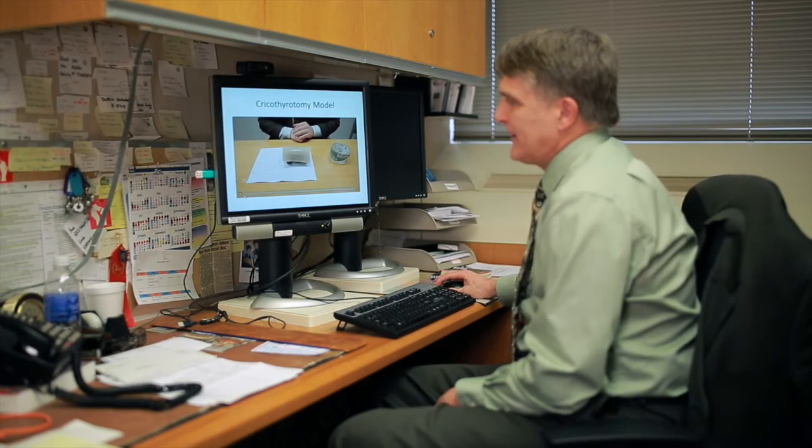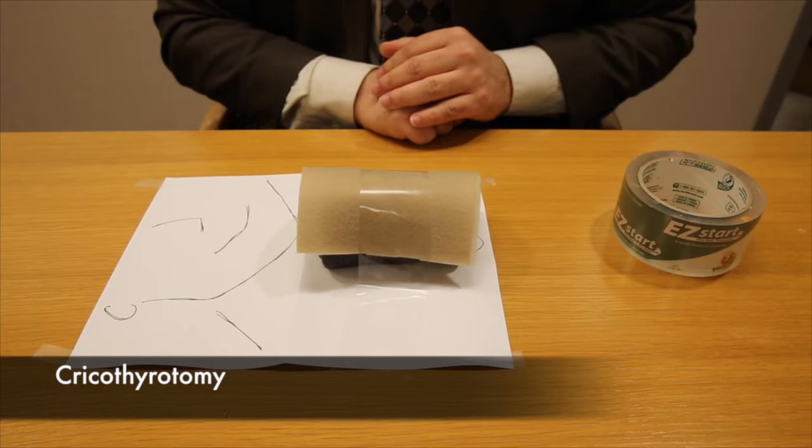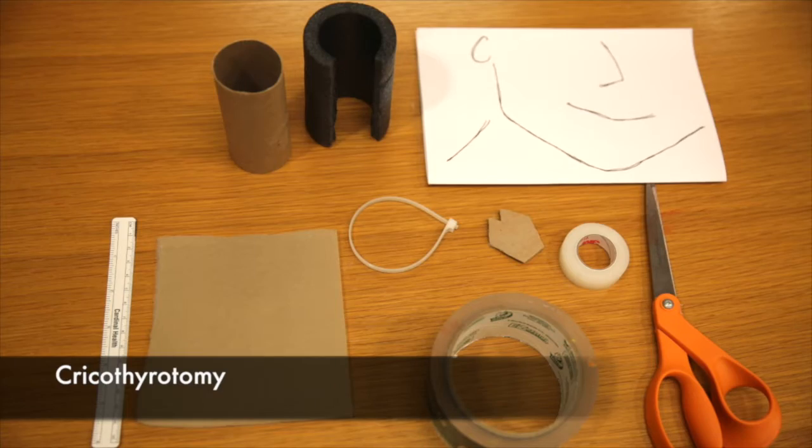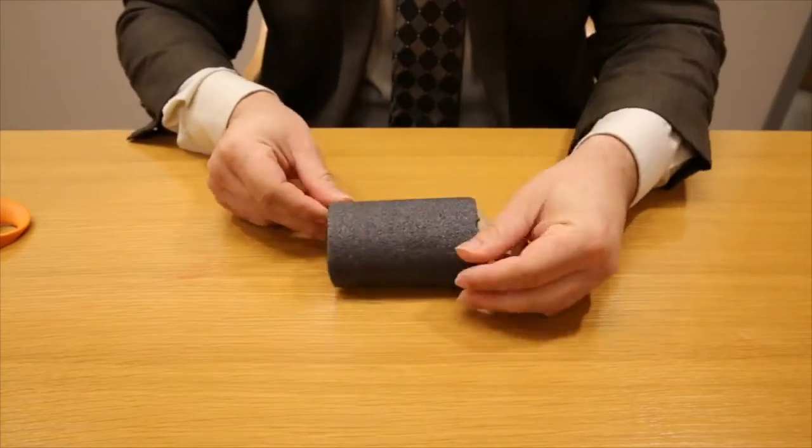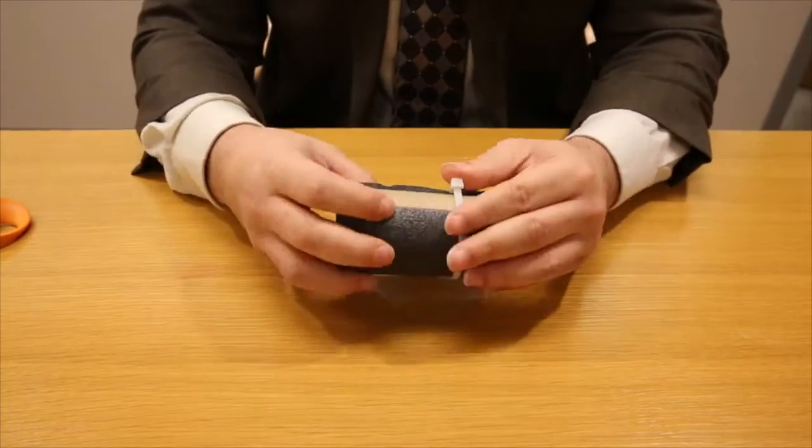This is our cricothyroidotomy model. It's a pretty simple model. It comes with a variety of things that are easily purchased at a fabric store or a hardware store and we put them together.